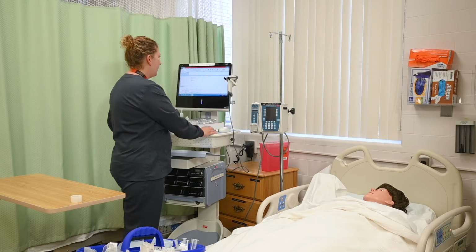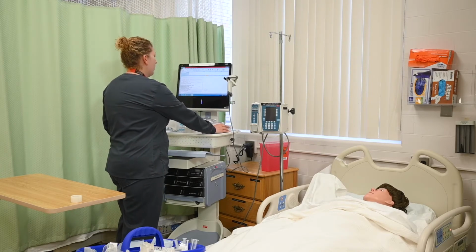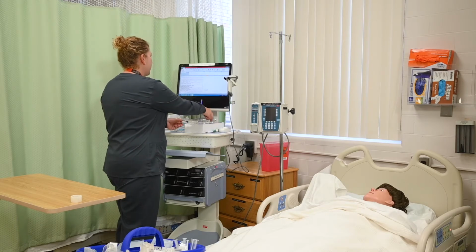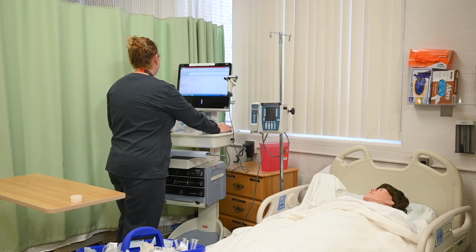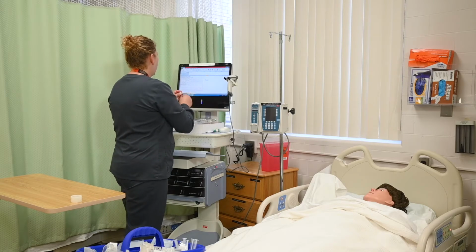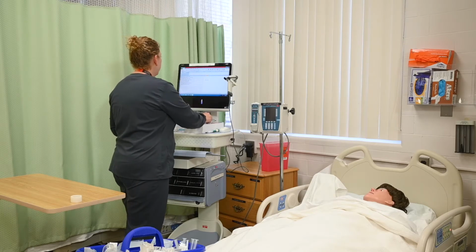I have IV practice, date of birth 3/3/87. 0.9 sodium chloride, continuous infusion, 100 mLs per hour. I have 0.9 sodium chloride IV fluid. IV practice, date of birth 3/3/87. 3 to 10 mLs, 0.9 sodium chloride flush, IV, PRN. I have 0.9 sodium chloride flush.